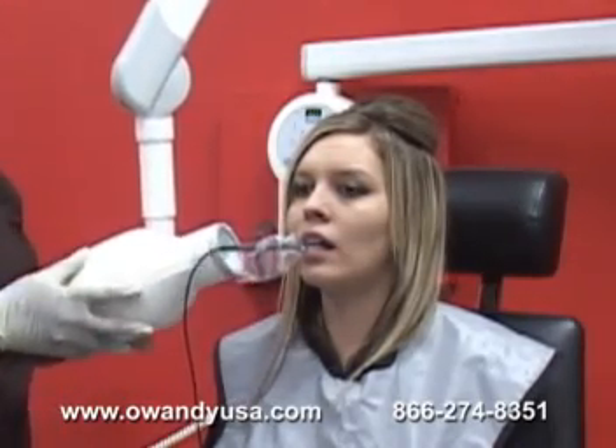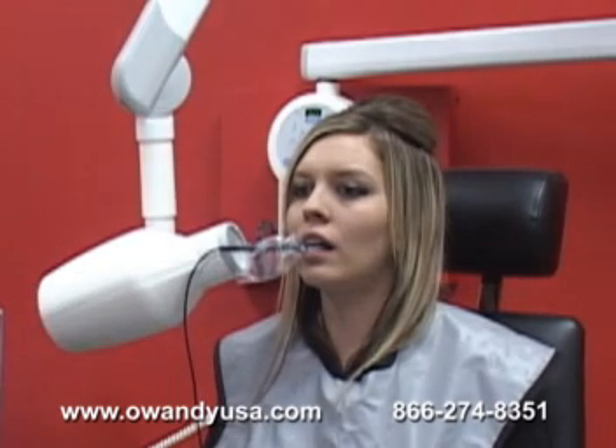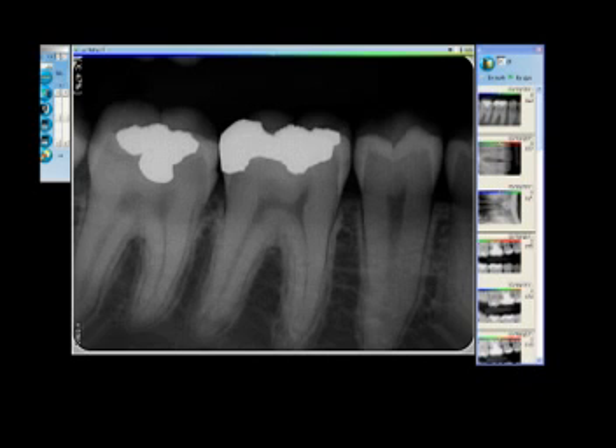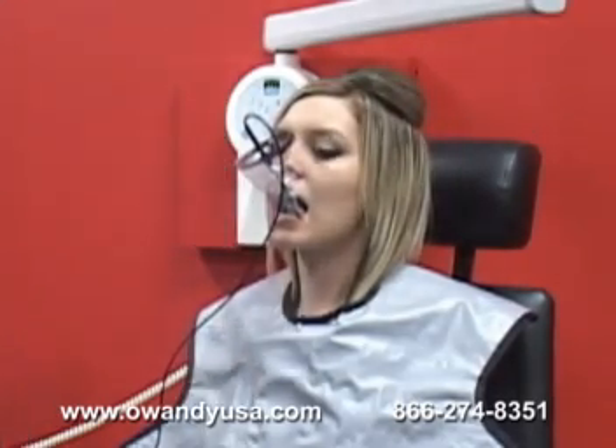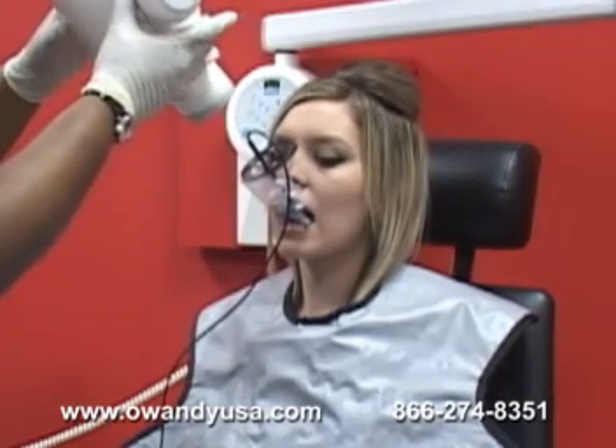With the integrated software, you can start with any position and move in any order you like. With the push of a button, the image is taken and appears on the display chart instantly. The rest of the FMX can then be achieved by simply moving the sensor to the next position without having to remove it from the patient's mouth.